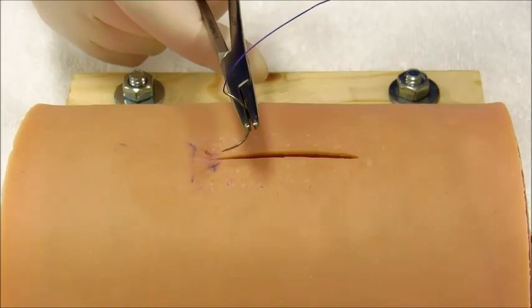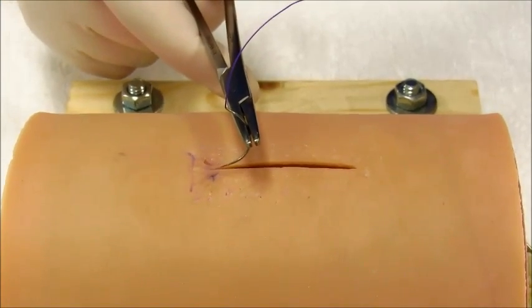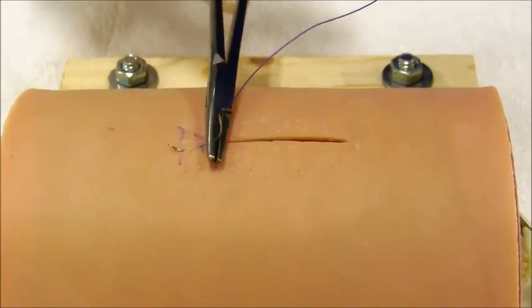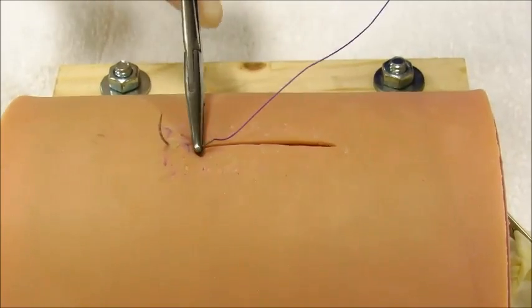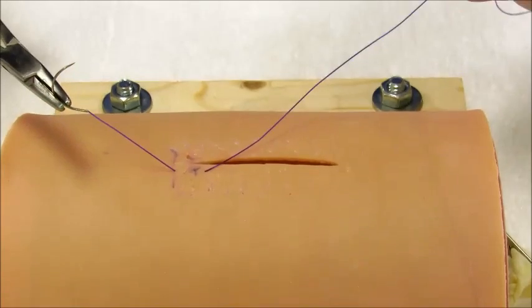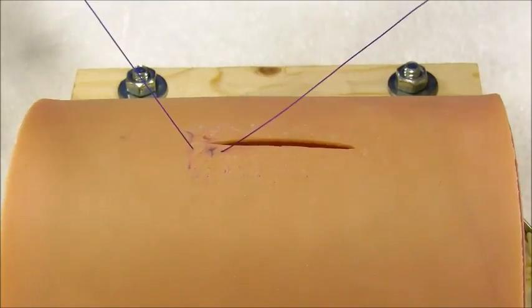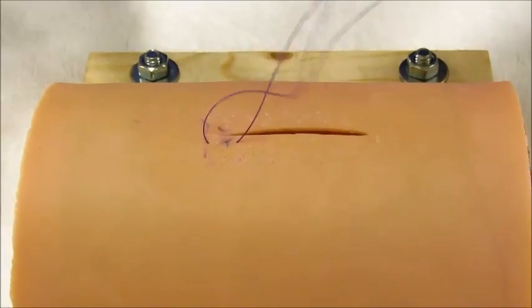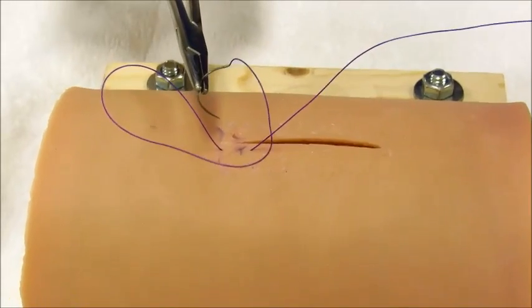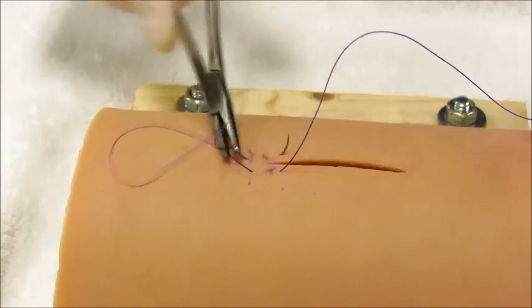So to bury the knot on this, I'm going to start by going away from the incision and parallel to the incision. And again, I'm not going to go into the lumen of this model. I'm just going to stay through the submucosa and serosa. A lot of times you can't even see necessarily that you're going through those layers. You learn the feel of what it feels like to go through the submucosa. Then I'm going to back the needle towards the incision to tie my knot.